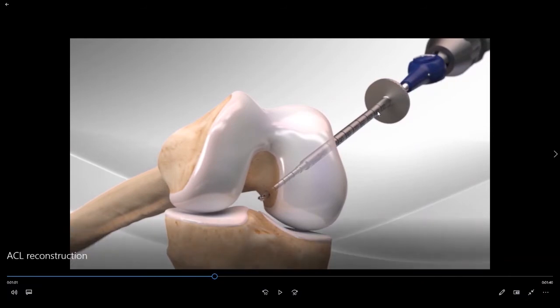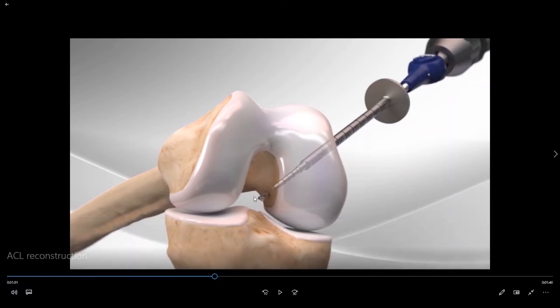The guide of the pin is then malleted 7 millimeters into the outside cortex of the bone. The pin diameter itself is only 3.5 millimeters. After harvesting and sizing your hamstring tendon we know exactly how large we would like your new ACL socket on the femur to be, and we can then set the flip cutter to the appropriate diameter of socket prior to drilling.